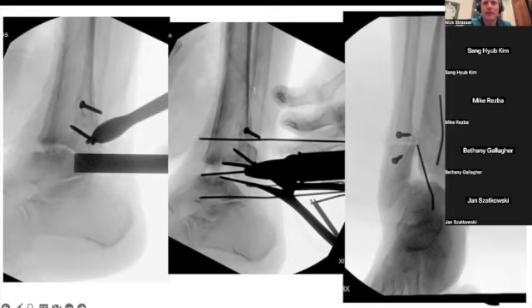Yes, I think it's a great approach. You see so much if you cut out the Achilles. Go through it. I mean, it's beautiful. They need a lengthening anyway.